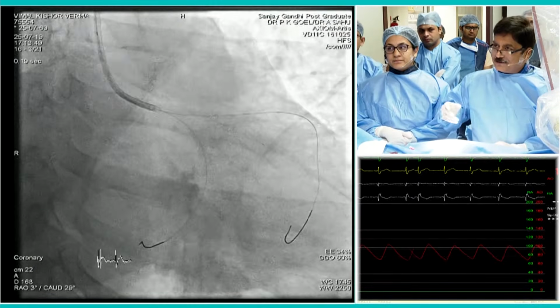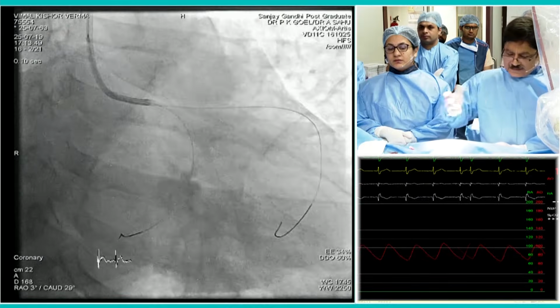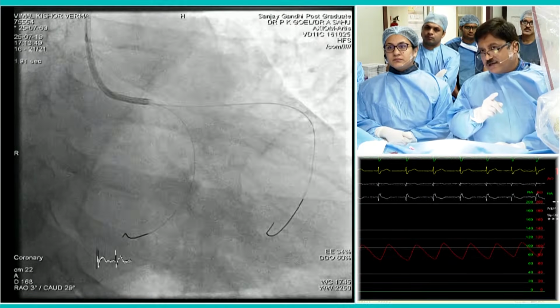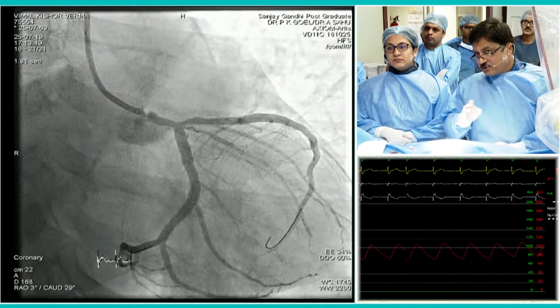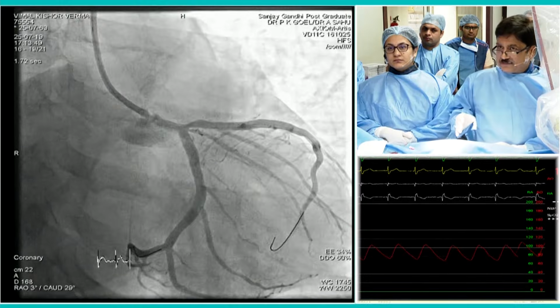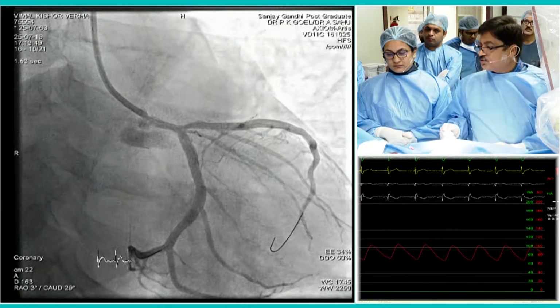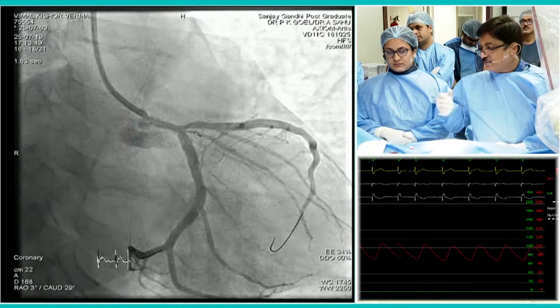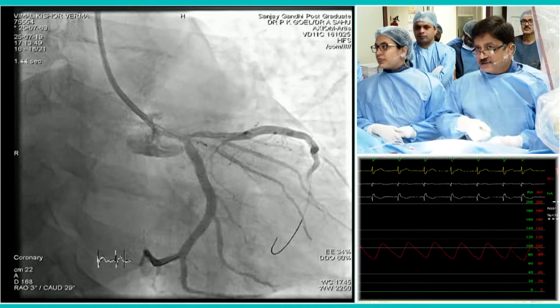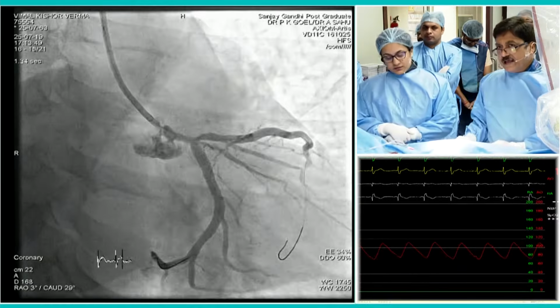If you try to calculate it, it will nearly come to whatever other calculations we have. But we've done that study, and doing left main imaging in most of the cases, you can get a good idea even on the angiogram. But I think for anyone who's wanting to do left main intervention or beginning or whatever, imaging is very important. That's what I think.